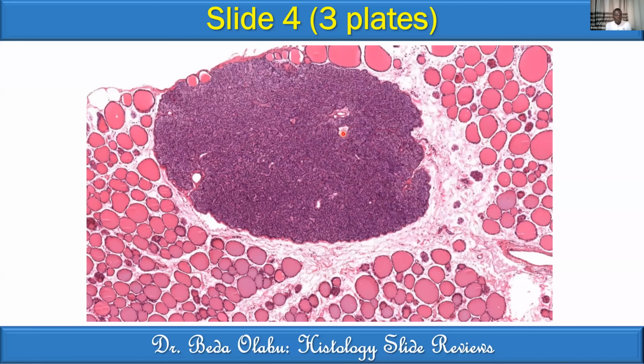Yeah, so just as has been said, the mass there is ovoid in shape, but an additional characteristic that I can see is that the cells in this structure are deeply staining. They have absorbed the stain, so it has serous cells. And there are some portions that are not picking up stain. I'm not sure if they're cells, but I think they're blood vessels. Could you go to the next slide?